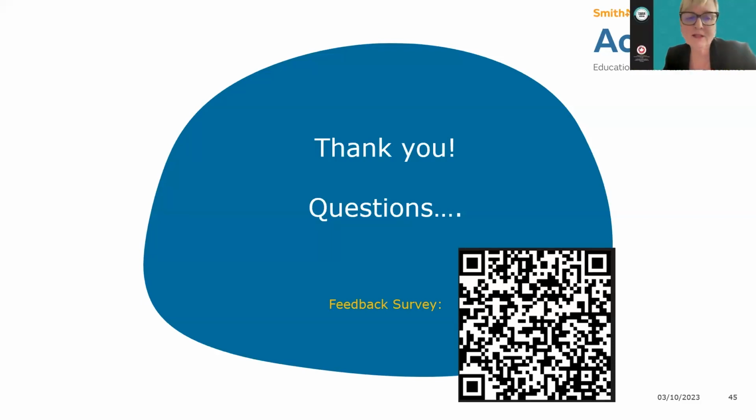Okay. And the next question is for David. Is there a bag that comes with this machine that can be used to transport it? Yes. So we have accessories with it. One is a carry bag, which includes a strap and a lid over it. So it looks almost like a camera case. It's quite good at disguising the pump if someone's out and about. Or there's just a separate carry strap, which clips over the handle ends, so you have an option to hang it over your shoulder. Okay.